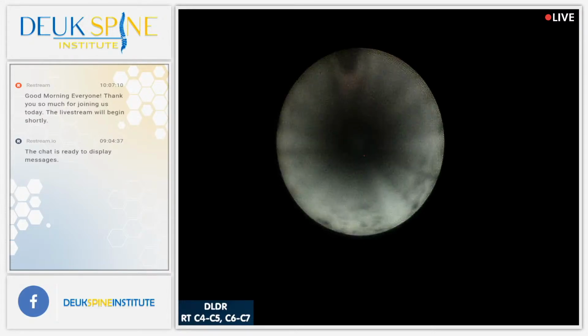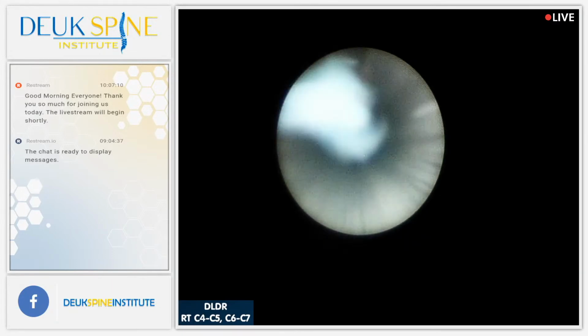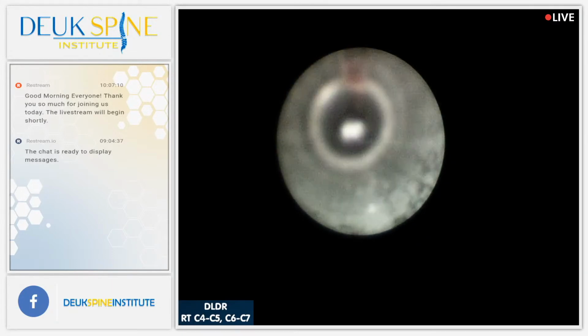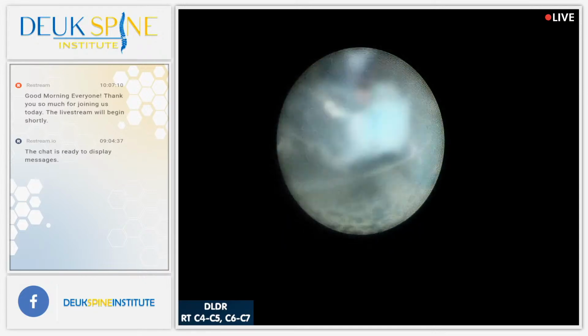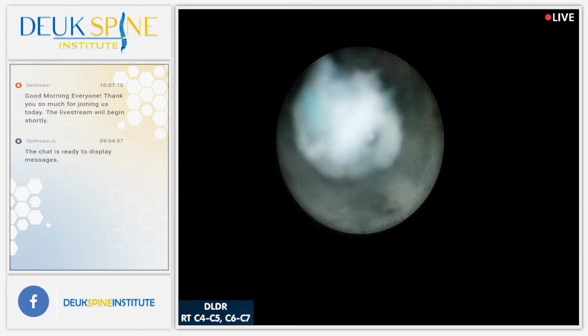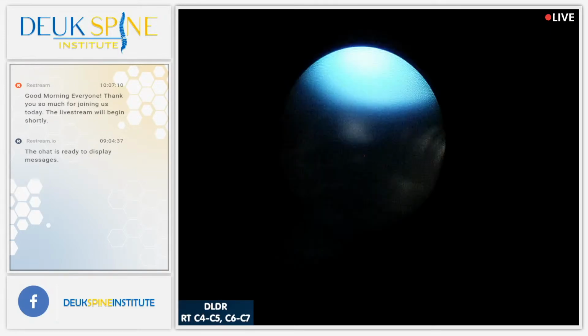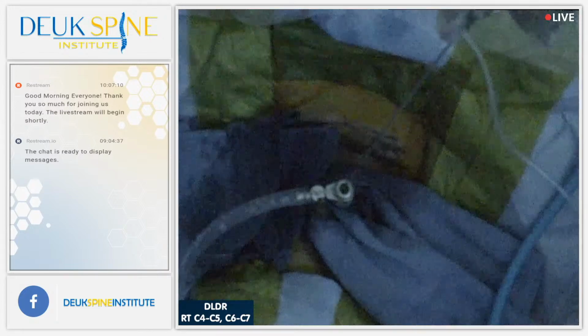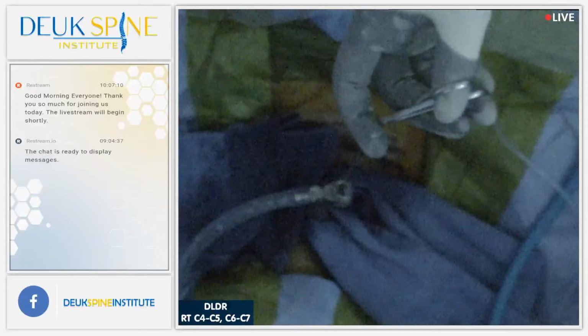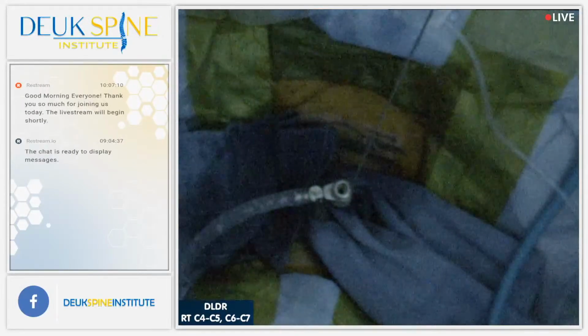I wonder if we're just having a little bleeding. What are we set at, 20? 20, yes, sir. All right. So those are all pieces of disc herniation already. Yeah, I see that, thanks. Thank you. Let me grab that out. For some reason, I'm a little blurry. I don't know if it's some bleeding or if it's something with the scope. I need you to help me figure that out.